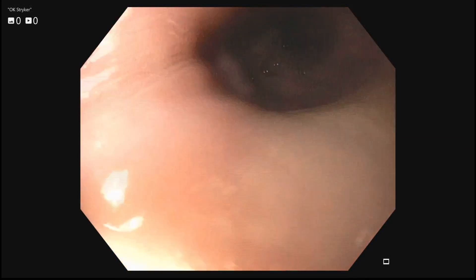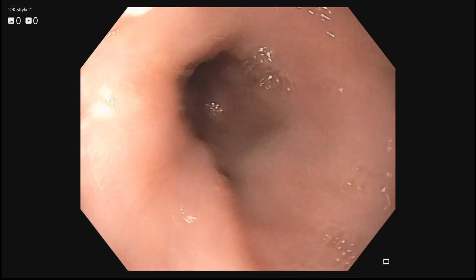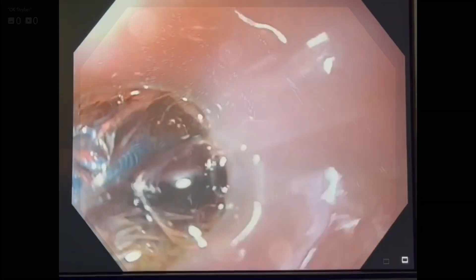This technique is easy to employ and can be done during sedated endoscopy. An example of retrograde balloon dilation.